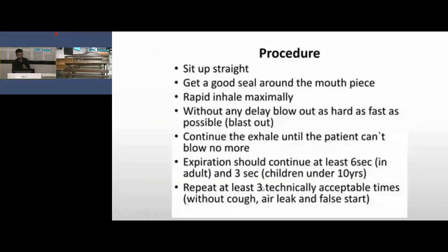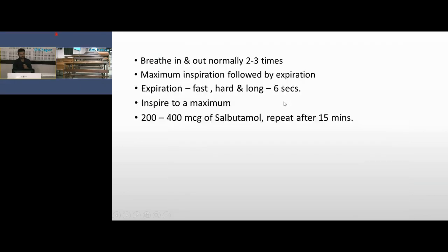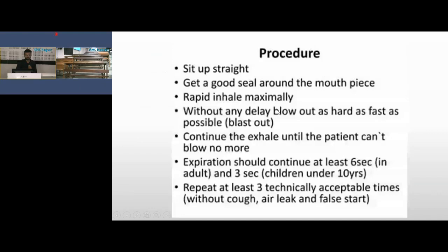Now let us discuss the procedure of spirometry. First of all, the patient should be comfortable, sit up straight, and get a good seal around the mouthpiece. Then breathe in and out normally 2 to 3 times, so that the patient is able to build up a rapid deep inspiration.